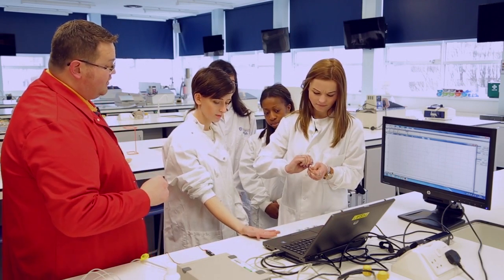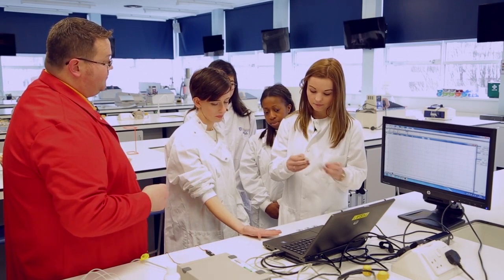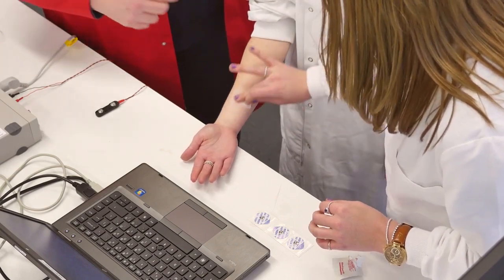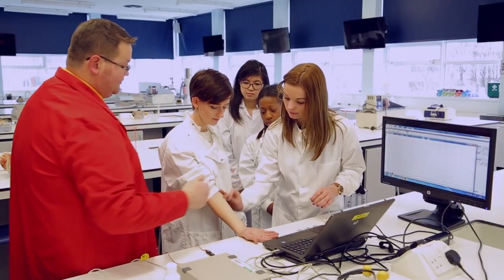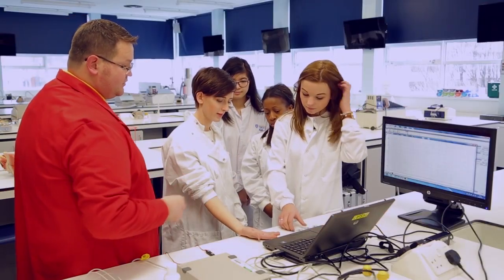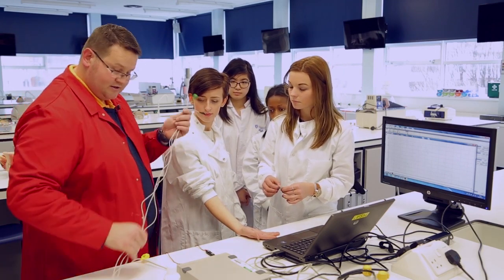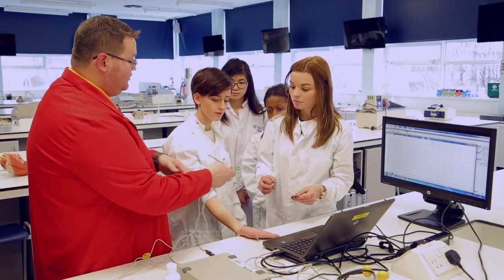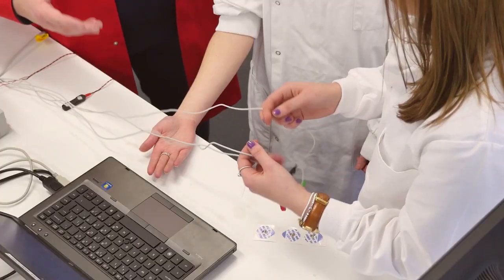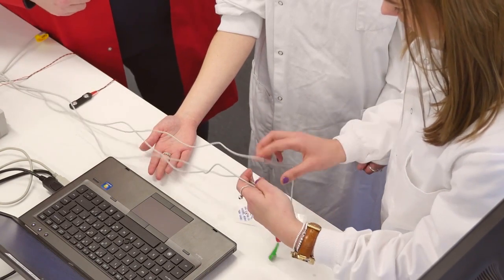Use a mediswab first of all to make sure there's no grease or anything on the skin — it'll allow adhesion and a good transfer. Do another one just so that we've got somewhere to place the earth. Then take the electrodes and connect them up to the earth, positive, and negative before you stick them onto the skin. It's easier rather than giving big indentations and trying to push against the skin of our subject.